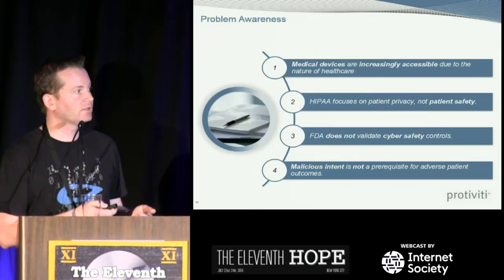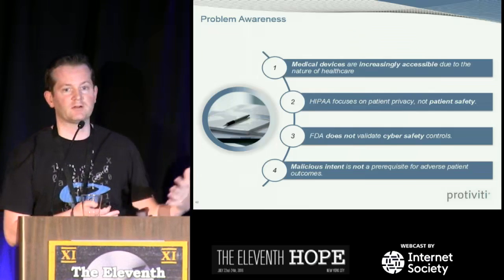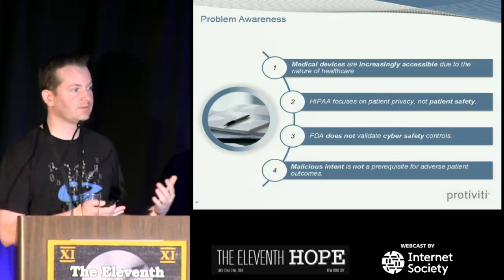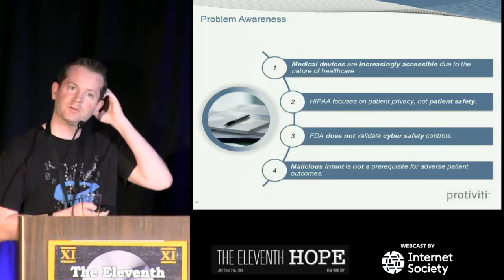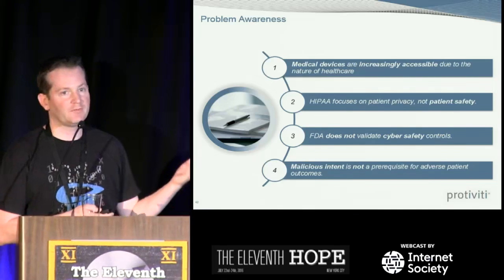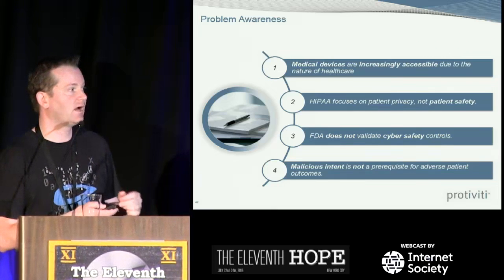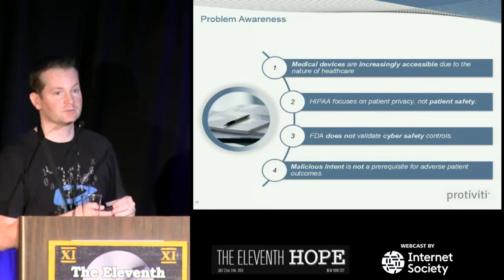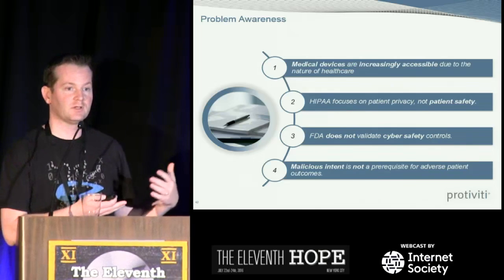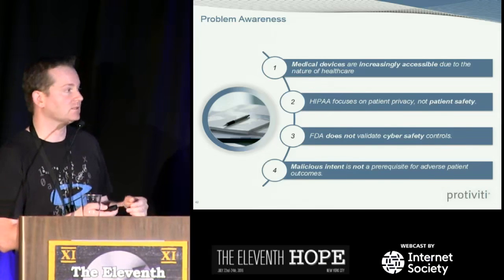So in terms of problem awareness, we talked about a lot of this. I'm not going to go through it in detail, but essentially we have all these medical devices connected to the internet. This is going to be growing in terms of connected medical devices in general. Tomorrow people aren't going to say, you know what, we should really just unplug everything from the network. That's not going to happen. We still have HIPAA, which focuses on patient privacy. We have the FDA, which does not validate cyber safety controls. I think a lot of people, especially new to this, might think the FDA should be or has been validating cyber safety controls on all these devices. That is not the case.